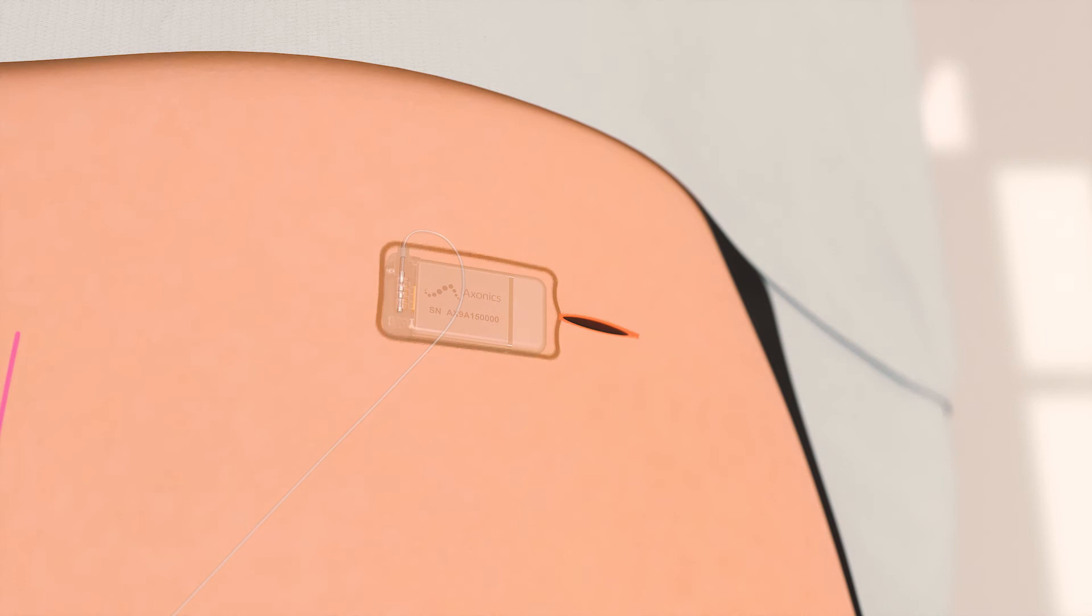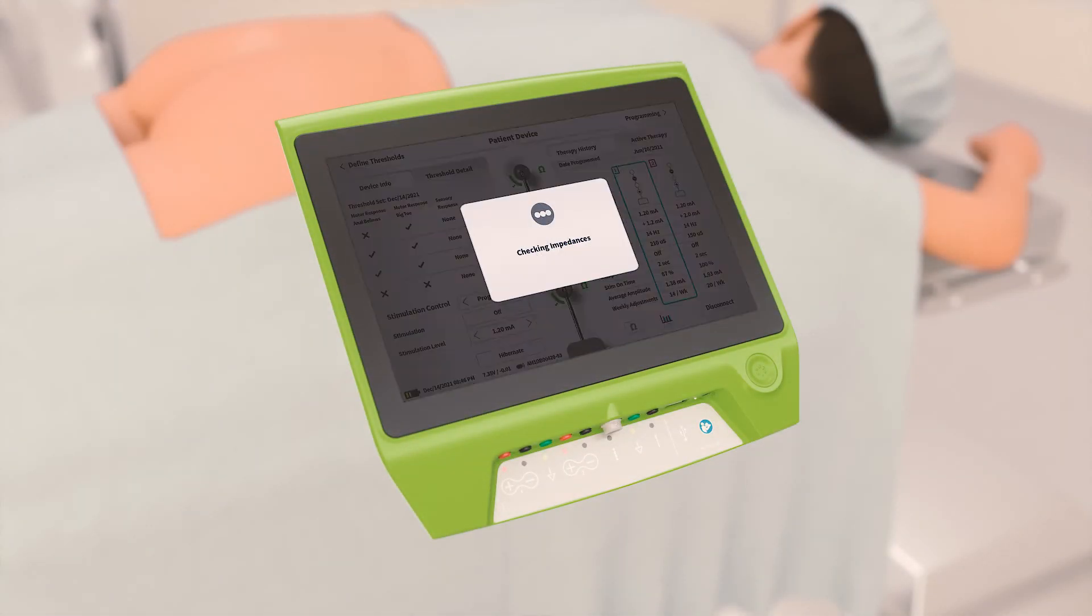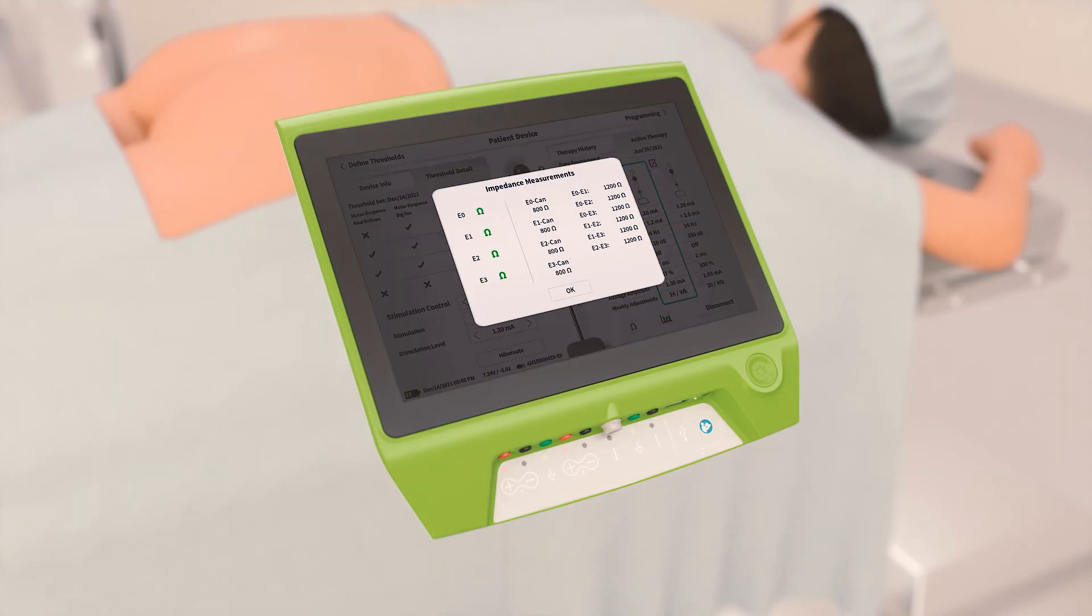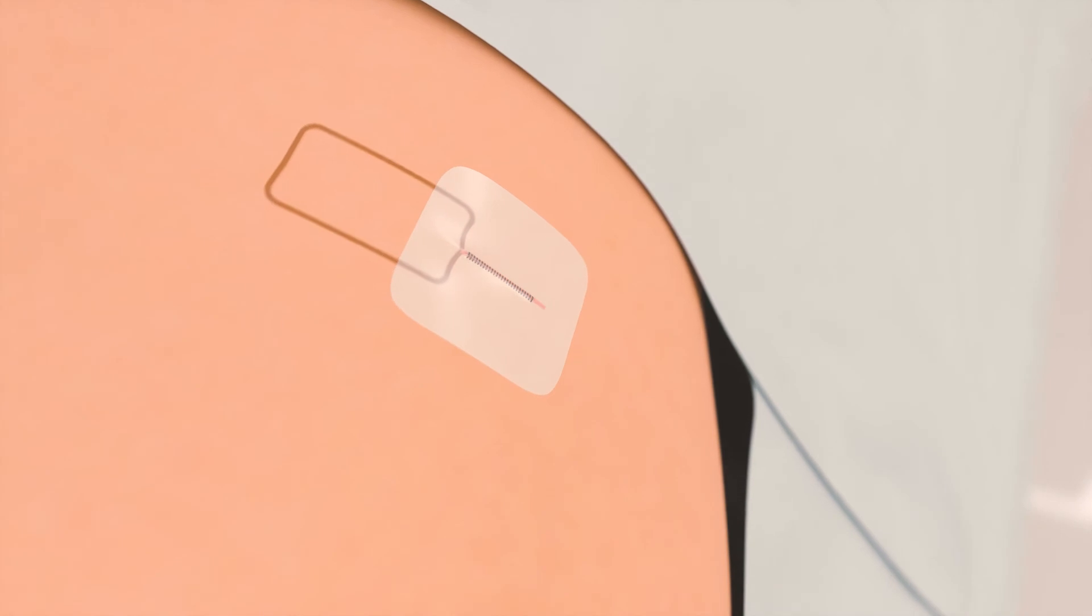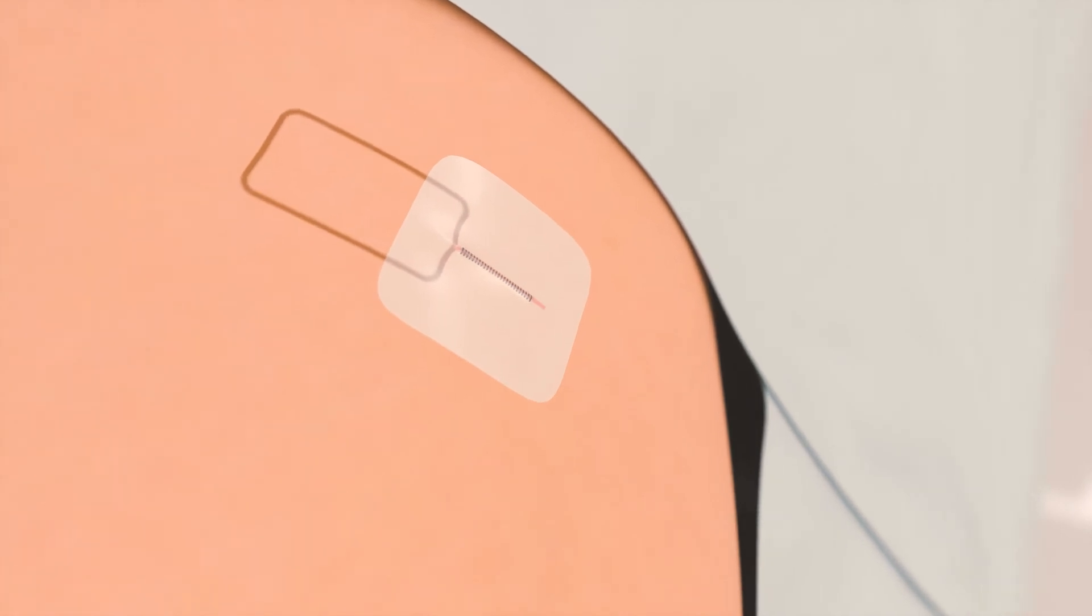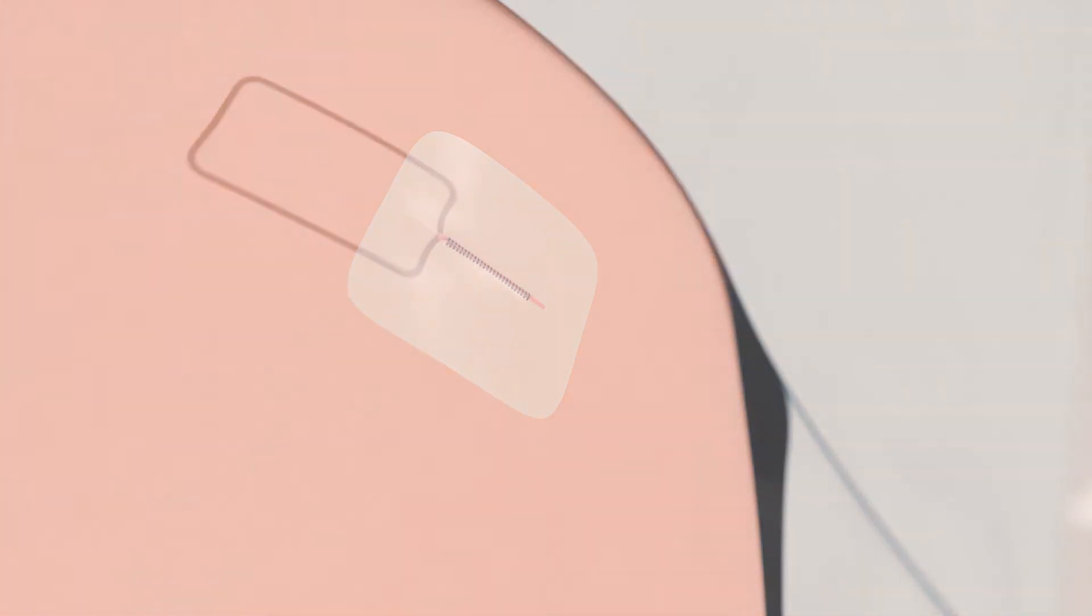Once the stimulator is placed in the pocket, the clinician programmer is used to wirelessly check impedances and motor response thresholds are transferred to the stimulator. The incision is closed with two layers of suture and dressings are applied.